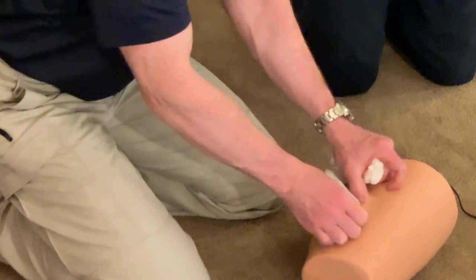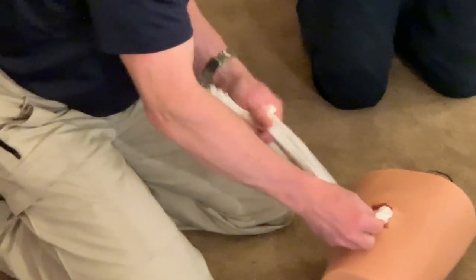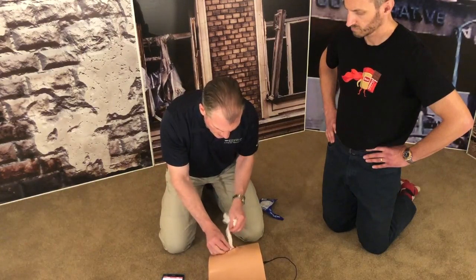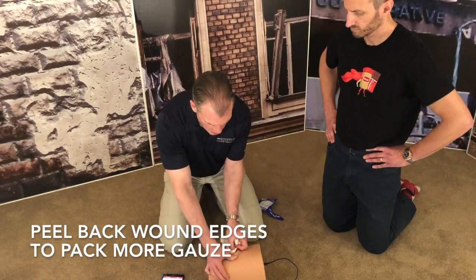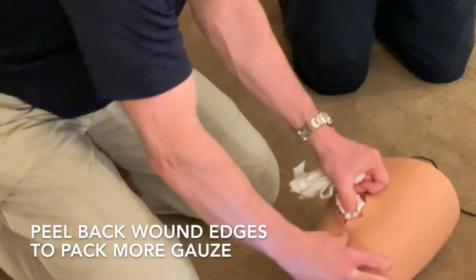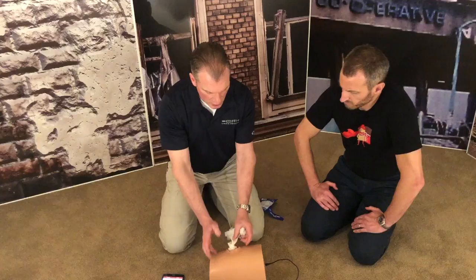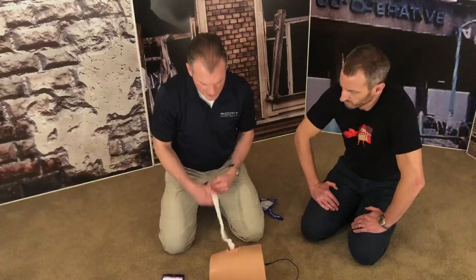Once it's fully packed and you're just about to the point you can't get any more gauze in there, you can start peeling these edges up to get under the edges — which is exactly what you do in an actual wound. Then when you let go of it, the tissue kind of compresses back on itself.